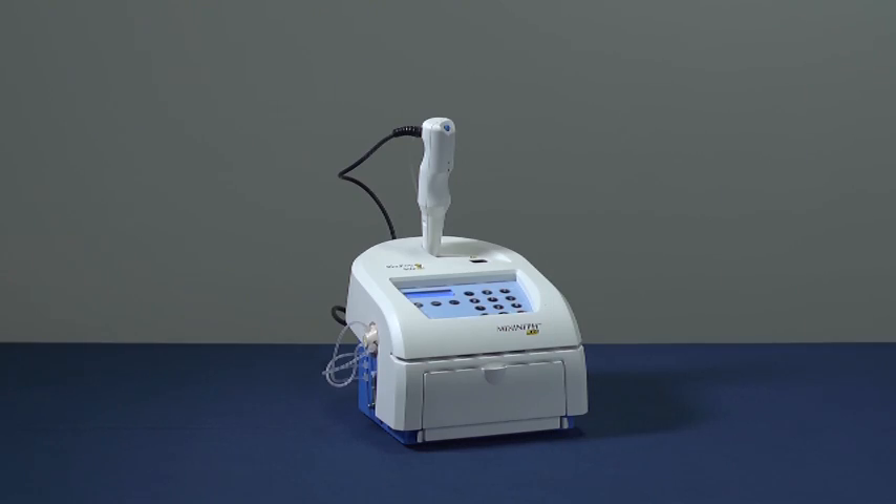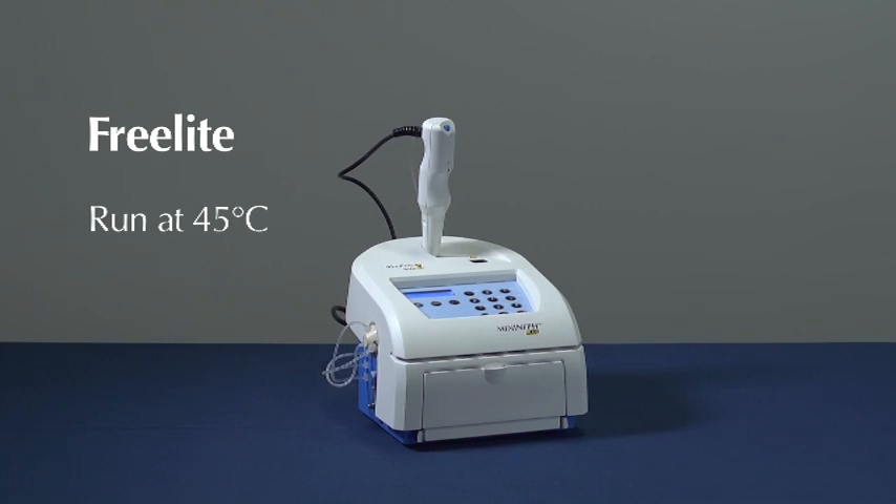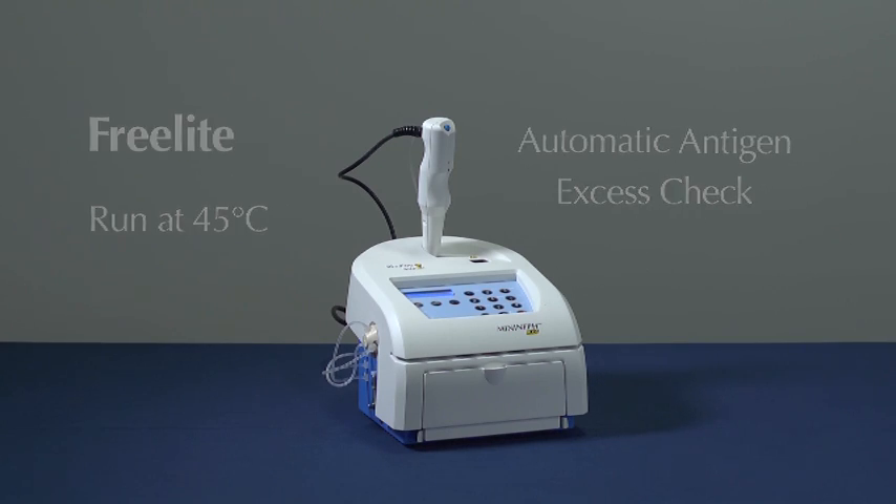The technology developed for this analyzer aids the running of the innovative FreeLite assay. The cuvette chamber and integrated pipette are heated to ensure all the reagents are at the required temperature. For added reassurance and confidence, there is an automatic antigen excess check for the FreeLite assay.